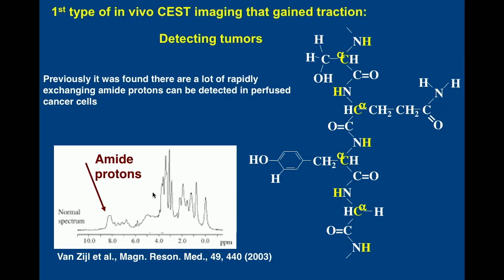This basically motivated them to try placing a saturation pulse here and then look at the water signal to do the inverse experiment and detect the tumors.